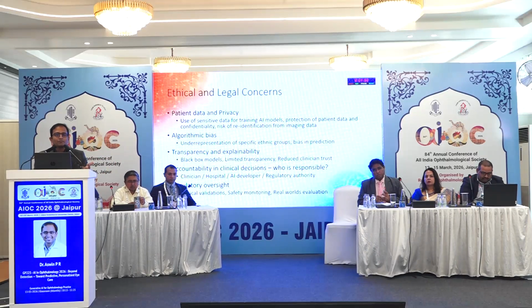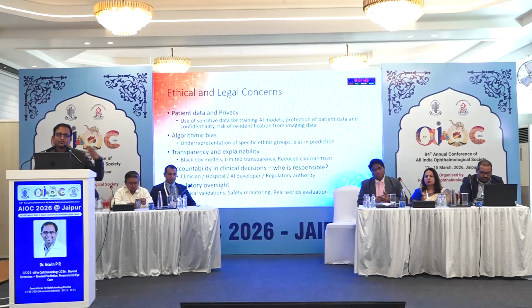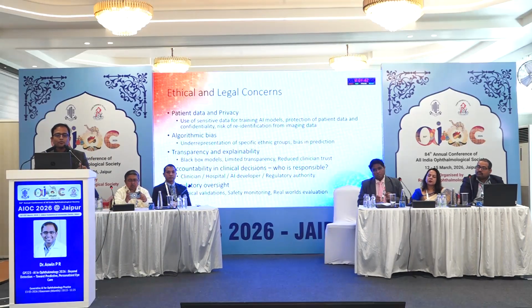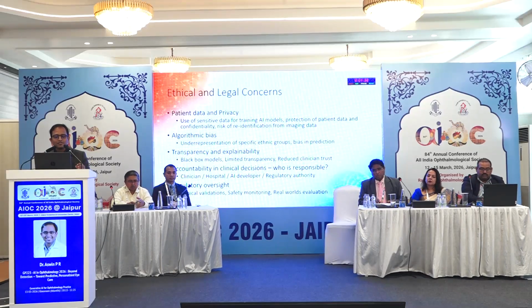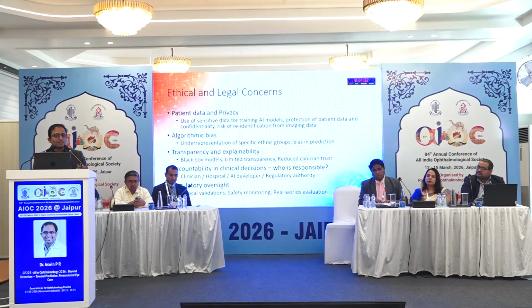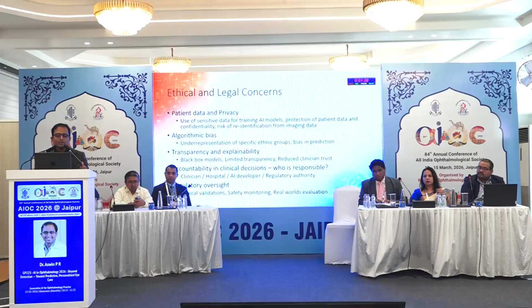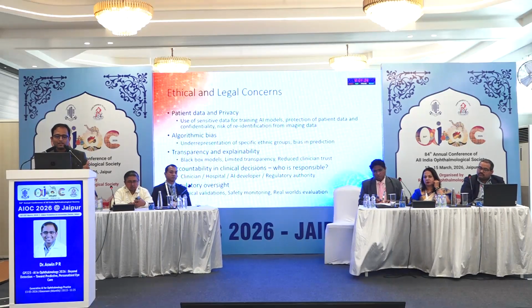Then you have algorithmic bias, like sir had already mentioned, people from the Northeast are not getting trained, the data is not available for training AI models. You can have gender bias. All these black box models and limited transparency can reduce clinician trust because there's no explainability or transparency. And then in case there's a medico-legal case, who is accountable? Is it the clinician, the hospital, the AI developer, or the regulatory authority? And then this requires safety monitoring, clinical validation and real-world evaluation.